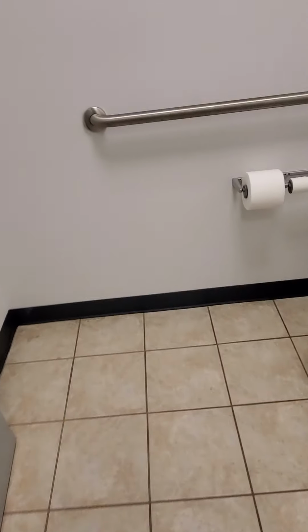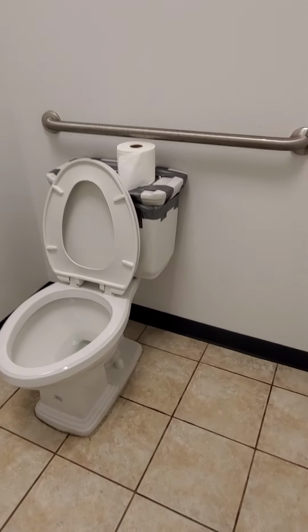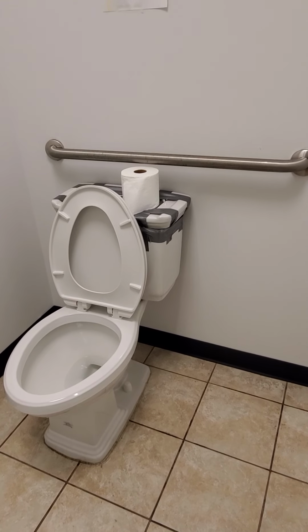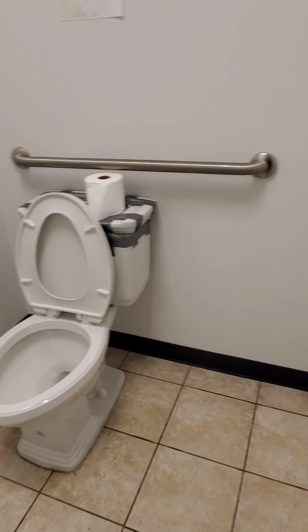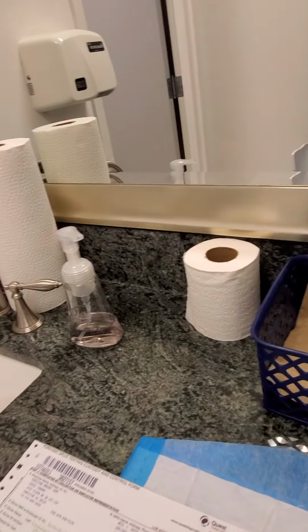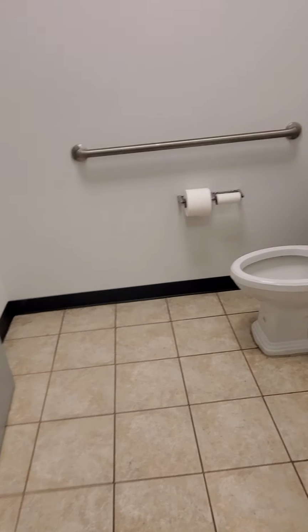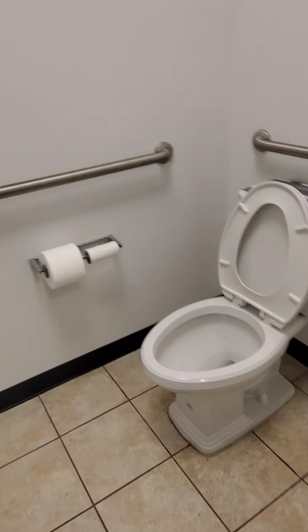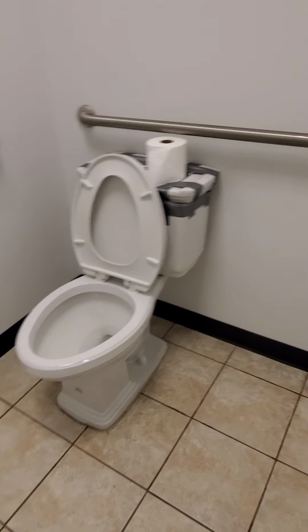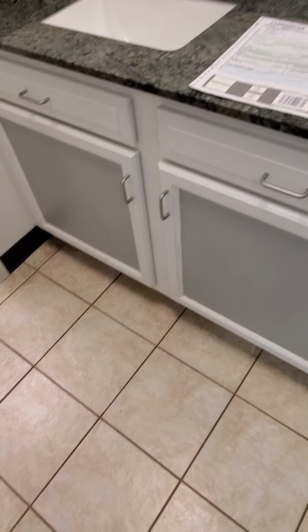You have 4 minutes. Everyone has 4 minutes to go in there and urinate. If they are in there over 4 minutes, either they can't go or they're up to something. So at 4 minutes, they got to come on out. You can knock on the door if the time is up and tell them, hey, it's time for you to come on out. Also instruct the patient to not flush the toilet. No one can flush the toilet. If they flush the toilet, you do not have to accept that specimen. You won't accept that specimen.